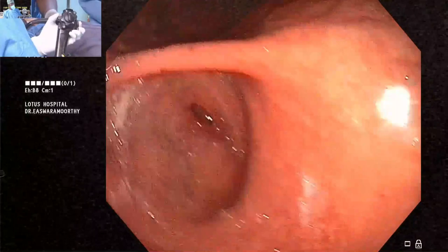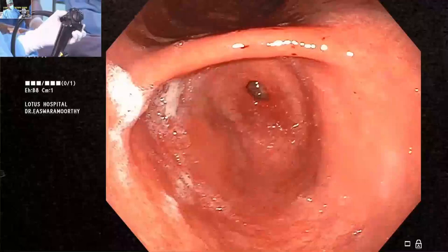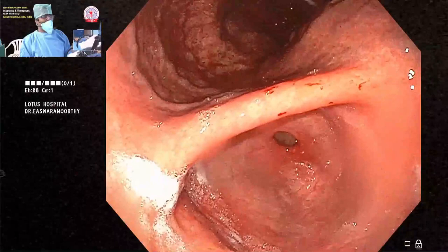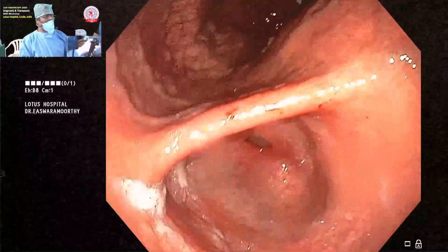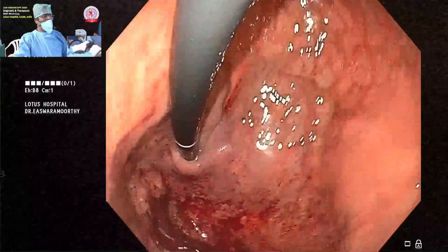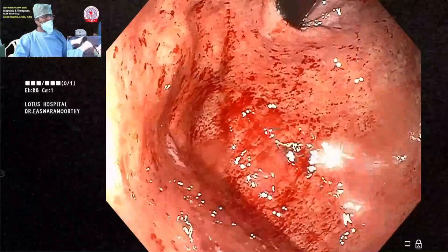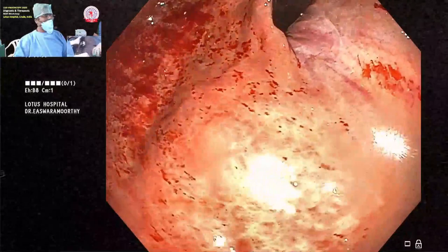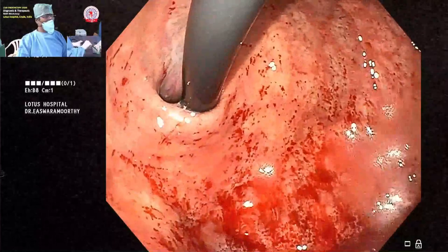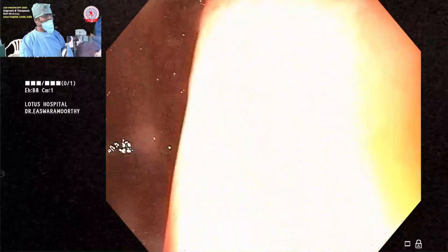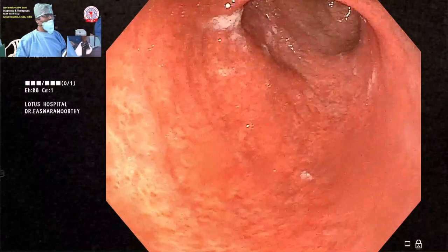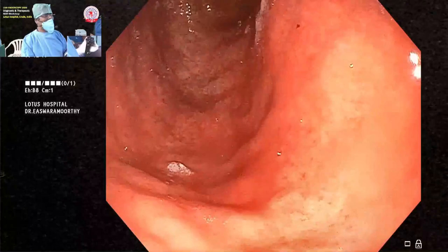After shortening the scope and falling back into the stomach antrum, I turn the big wheel slightly toward me and see a ridge-like structure stretching from about eight o'clock to two o'clock — this is the incisura along the lesser curve. Performing a full J-maneuver: flex fully, apply anti-clockwise rotation, and pull the scope back. You can see the congestive gastropathy clearly, and because the patient was retching slightly, there is venous oozing — a cause of chronic anemia. Importantly, there are no fundal varices.